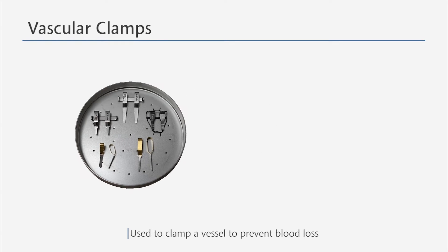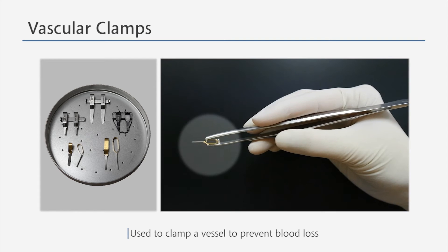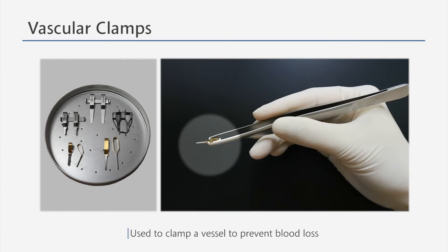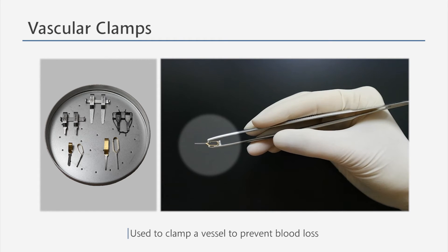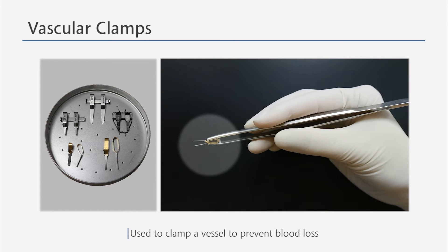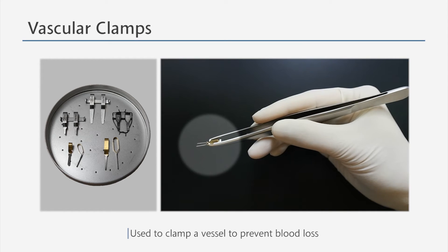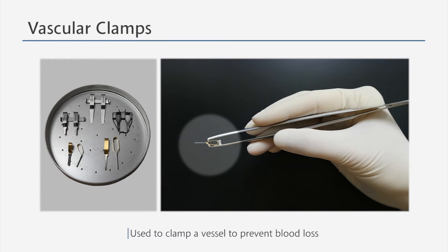Vascular clamps are used when performing an anastomosis. They clamp the end of the vessels to prevent blood loss. There are two different types of vascular clamps, one for the arteries and one for the veins. The clamps for the arteries have bent tips to prevent slipping from the thick artery walls when placed on the vessels. Those for the veins have flat edges. The vascular clamp provided during the microsurgery training can be used for both the arteries and the veins. Please check before and after the training if you have them so as not to lose them.